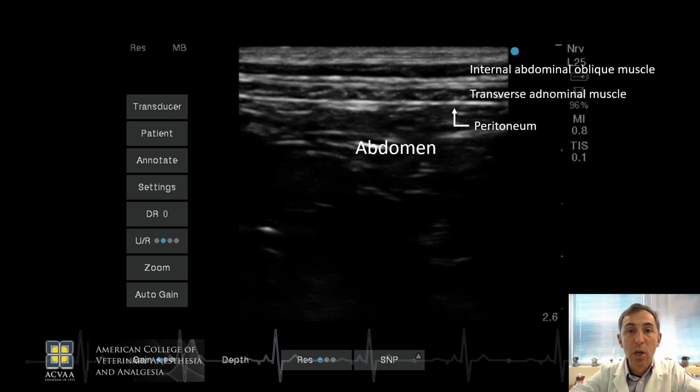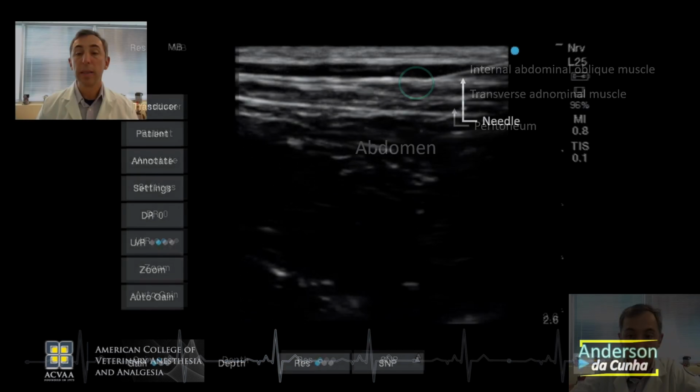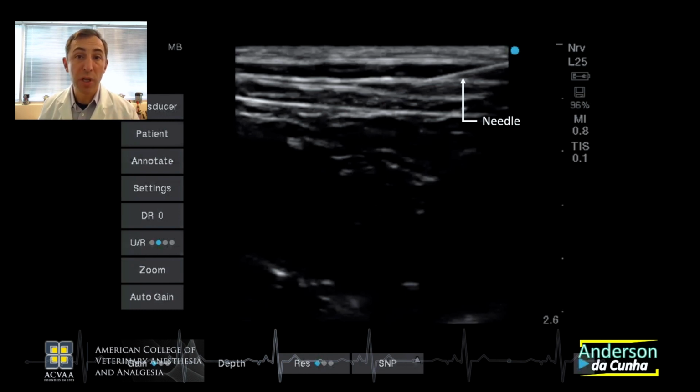Now, without the highlights, you can clearly see those white lines, right? And the needle is going to be entering this specific area highlighted in green. This is the transverse abdominal plane site where you're going to deposit your bupivacaine. This is the area in between the deep fascia of the internal abdominal oblique muscle and the superficial fascia of the transverse abdominal muscle. In this video, we will observe a positive or successful injection of bupivacaine at the transverse abdominal plane space. As you see, these two white lines will start opening in a very organized manner. And that is the positive visualization of your block. So let's watch the video.